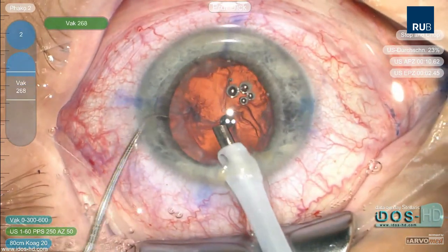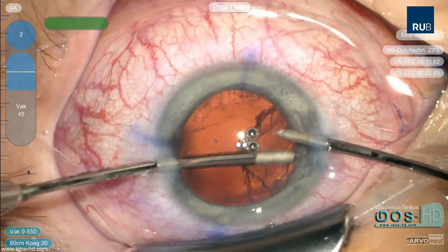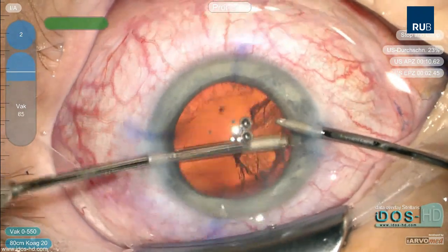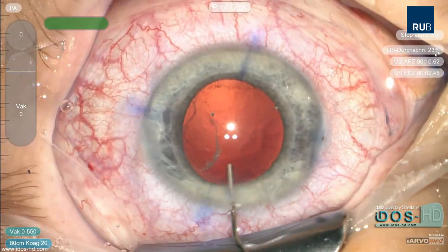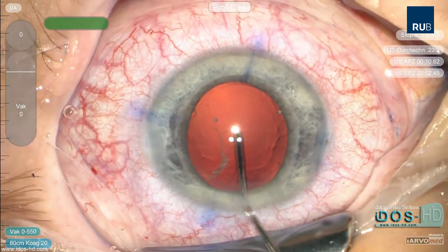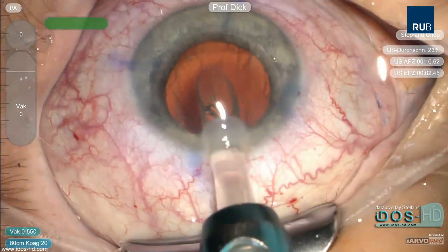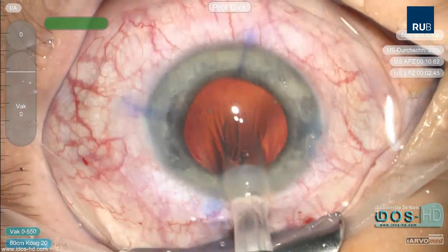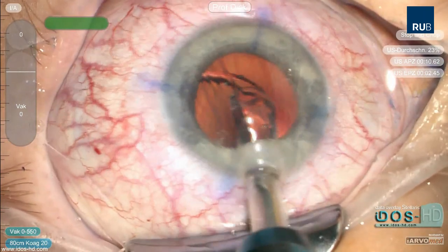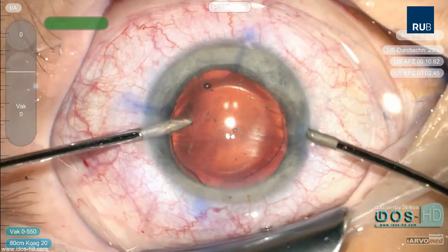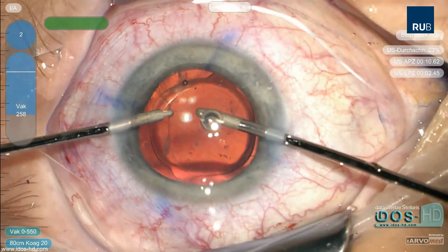The cortex is removed with bimanual irrigation and aspiration. The anterior chamber is filled with OVD and a toric intraocular lens is carefully implanted. Bimanual irrigation and aspiration is then used to remove the OVD.